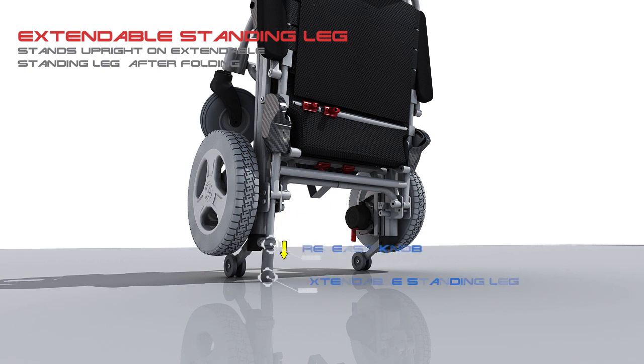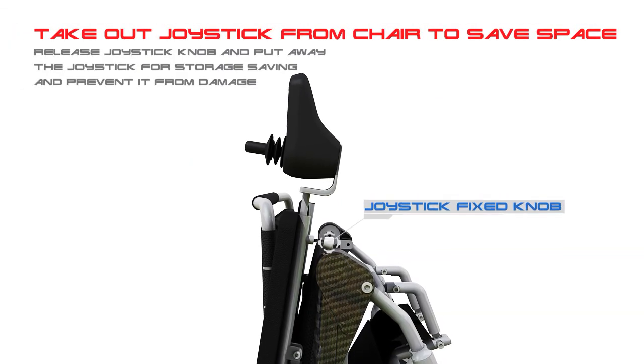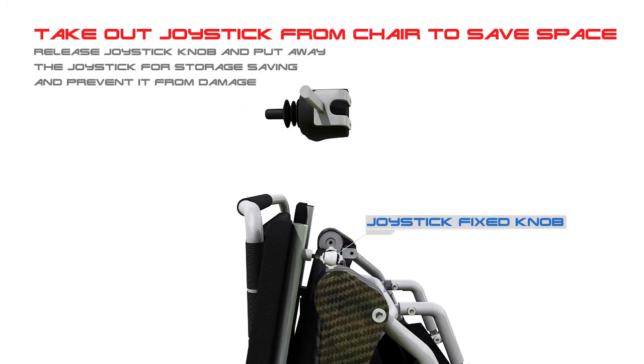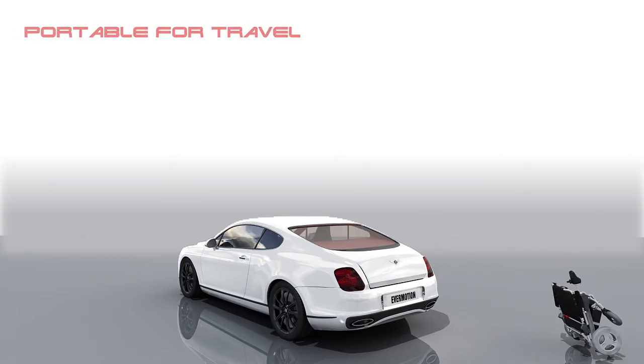Extendable standing leg: the chair stands upright on its extendable standing leg after folding. You can also take out the joystick from the chair to save space — release the joystick knob and put it away for storage, saving space and preventing damage. Portable for travel.